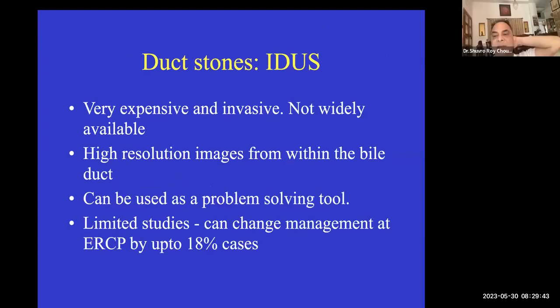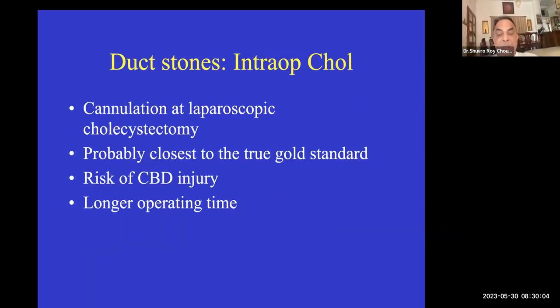But that is Spyglass, Makhanda. Yes, Spyglass cholangioscopy. That is what I mentioned. It's not available everywhere. No, it is available in our hospital. But let me put it here. Look, intraductal ultrasound. Not only a Spyglass, you can also do intraductal ultrasound, where the endoscopist can go through the mother scope and then through the bile duct.